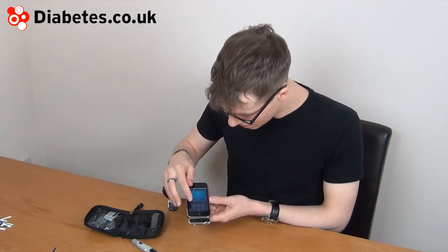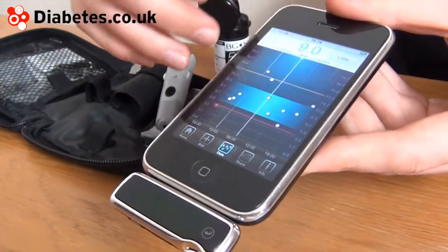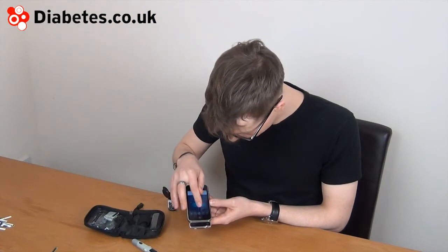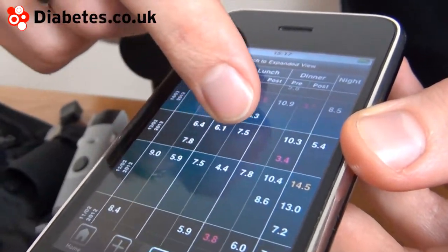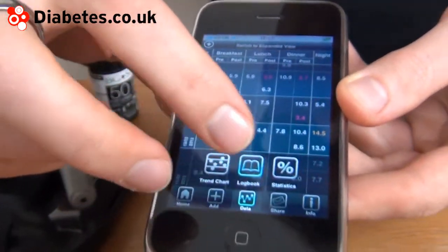The IBG Star allows us to see a variety of trends. You can see a scatter plot of your readings over the last number of days. Furthermore, you have a diary which has all your results at different times of the day in tabular form.